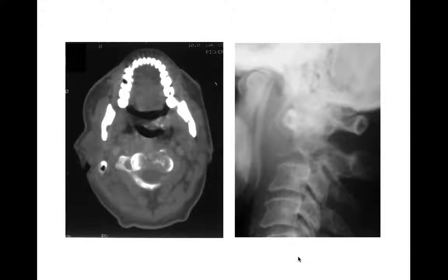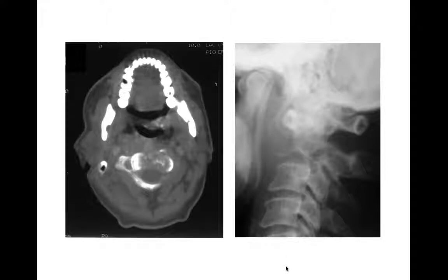Here's an example of a giant cell tumor — a lytic lesion involving C2, not well seen on radiograph but better on CT. This one may have some internal matrix, making osteoblastoma a good thought here too. Giant cell tumors are found in vertebral bodies, and this one ended up being a giant cell tumor. ABC is also reasonable to consider. In an older patient, don't forget mets and multiple myeloma.